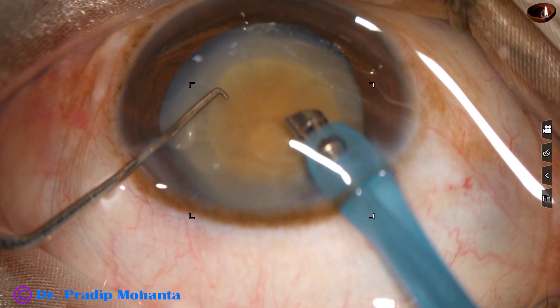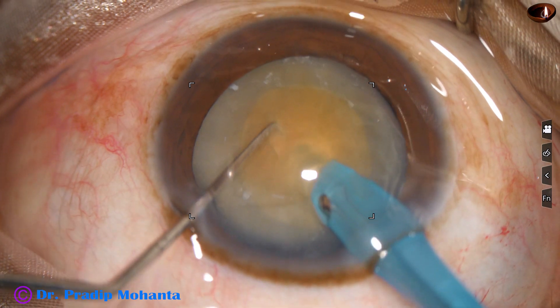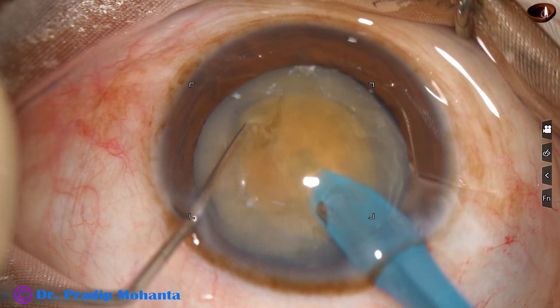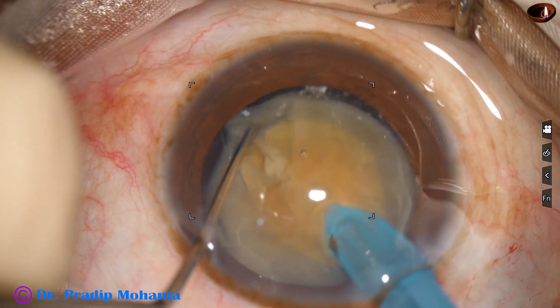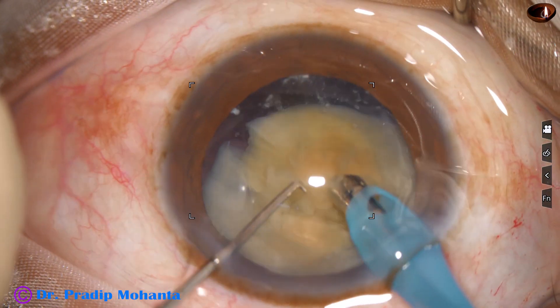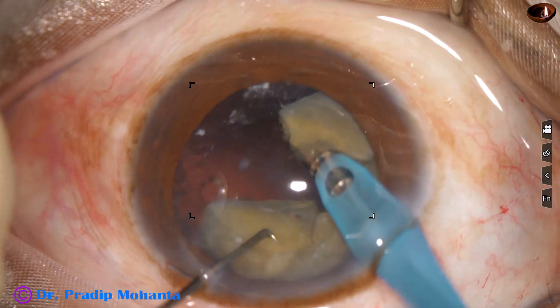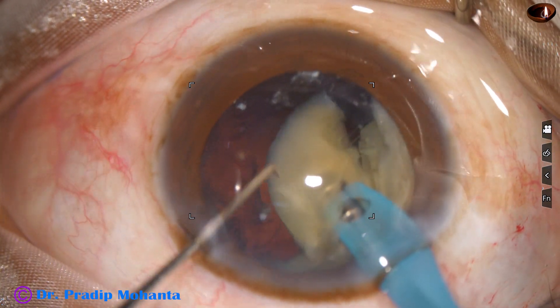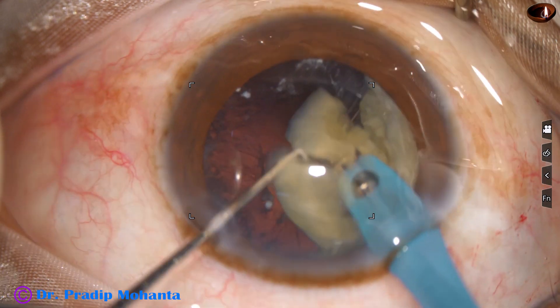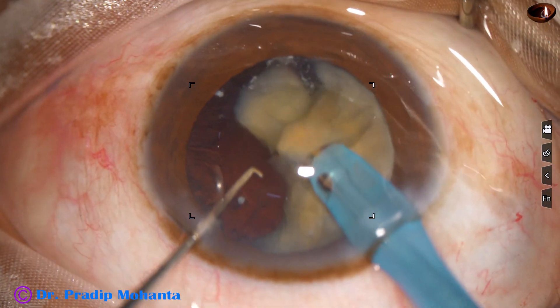Now see how to chop this nucleus. Bevel down — go into the substance of the nucleus, bevel down. With bevel half, you cannot hold the nucleus. And now bevel sideways and chop. I am emulsifying this free nuclear piece.